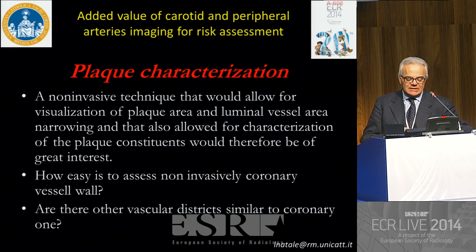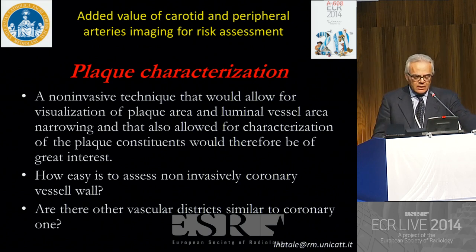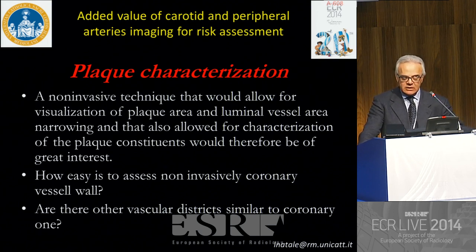How easy is it to assess the coronary vessel wall non-invasively? This is still a problem. It is partly solved by CT, but not completely, because there are invasive techniques that do it better. And the second question is, are there any other vascular districts that can be considered similar to the coronary district? In other words, can I look non-invasively at a larger and easier-to-study vascular district to assume a risk for coronary artery disease?